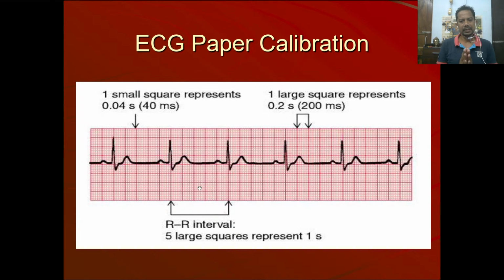So in the normal sinus rhythm, you will see normal looking, good looking P waves. They won't be irregular or haphazardly pointing here and there. It will be centralized, a nice peak, not very flat, not very tall, a good amplitude P wave, and then a good QRS complex, and a good ST, and a good T, starting and ending at the isoelectric line. Normal sinus rhythm. All the P waves in the rhythm strip, they will look nice and identical. Okay, like in this rhythm. This is an ideal example of a normal sinus rhythm.